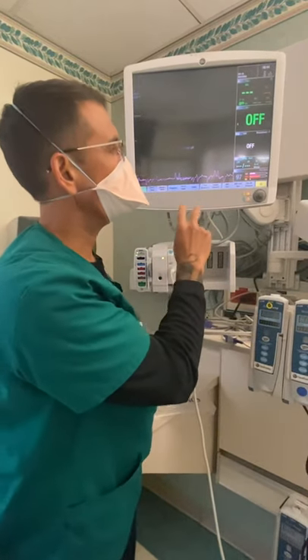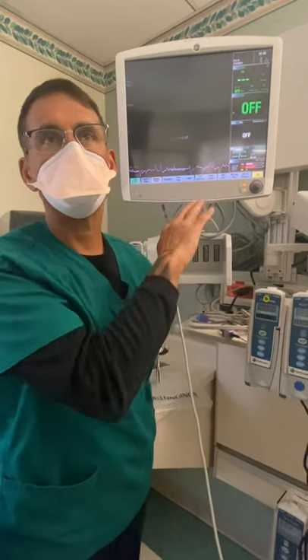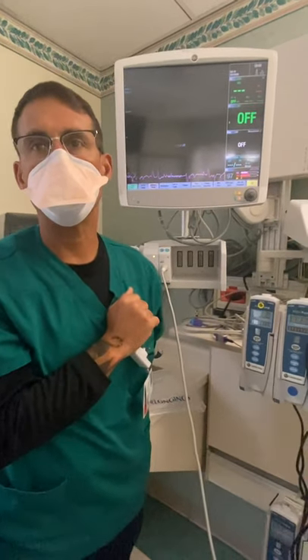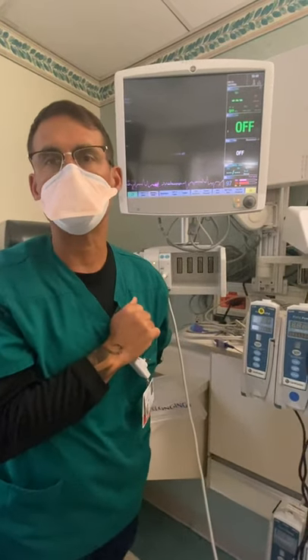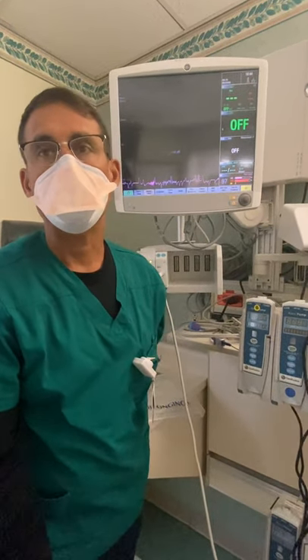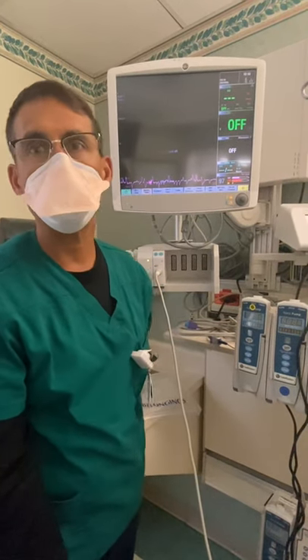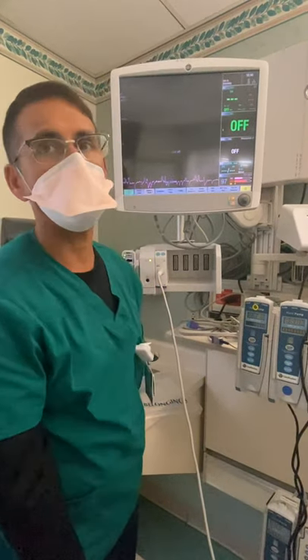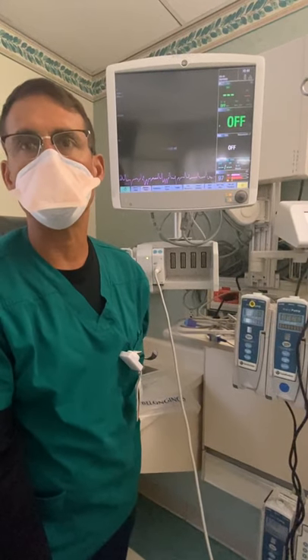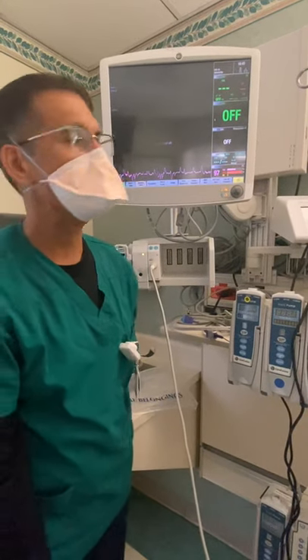Now, let's say that you have a patient who has a number of 10, and there's basically no waveform on there, and you've weaned off all the sedation, and the patient's still not doing anything. You probably should notify the doctor because that patient's probably brain dead, and they might need other tests to see if there's any actual activity. This measures EEG waves, but it does not diagnose. So it doesn't know if the patient is seizing or if there's any abnormalities. It only knows basically the wave height and the intensity of the wave, not the frequency of the waves.